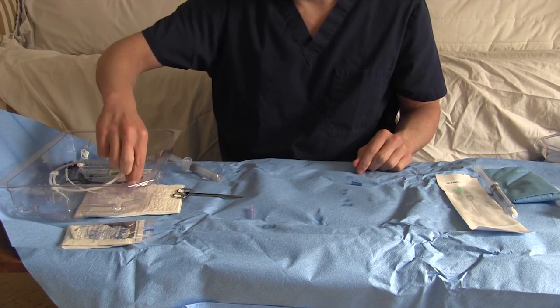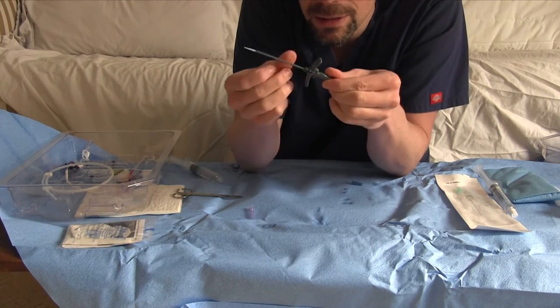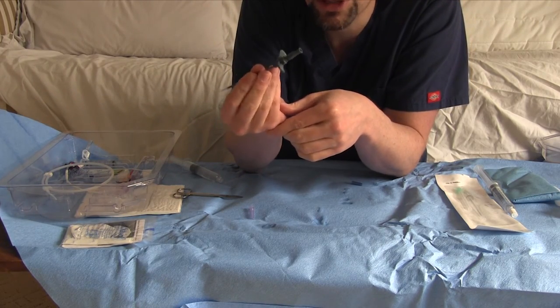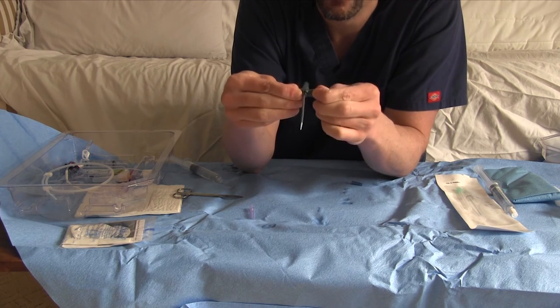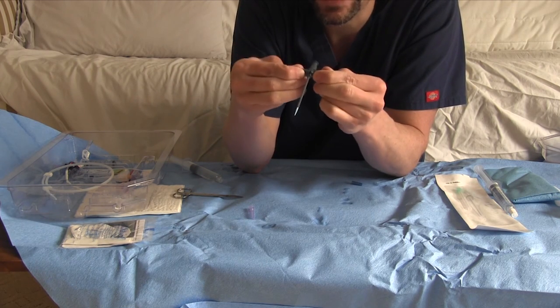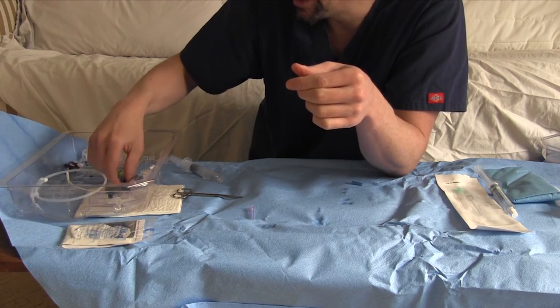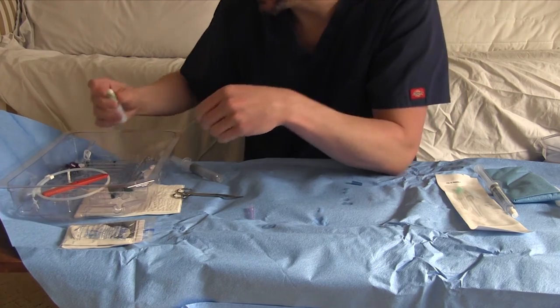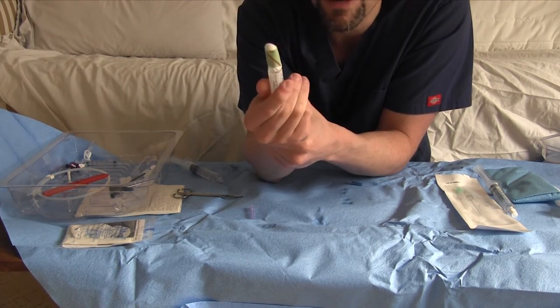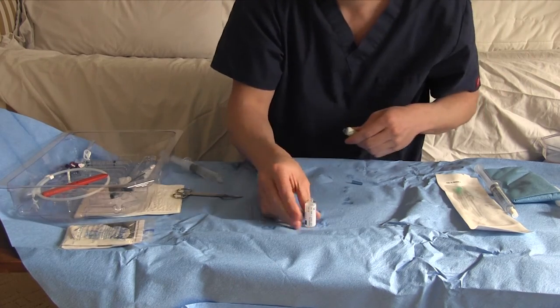And the other parts of the kit: this is your dilator assembly. This is what's going to allow you to actually transition from the wire to something the midline will fit in. I'll show you how to use that in a sec. You have your scalpel. And then you've got some lidocaine in here. It's very nicely covered with a gauze so you can't cut yourself. Let's crack that bad boy.